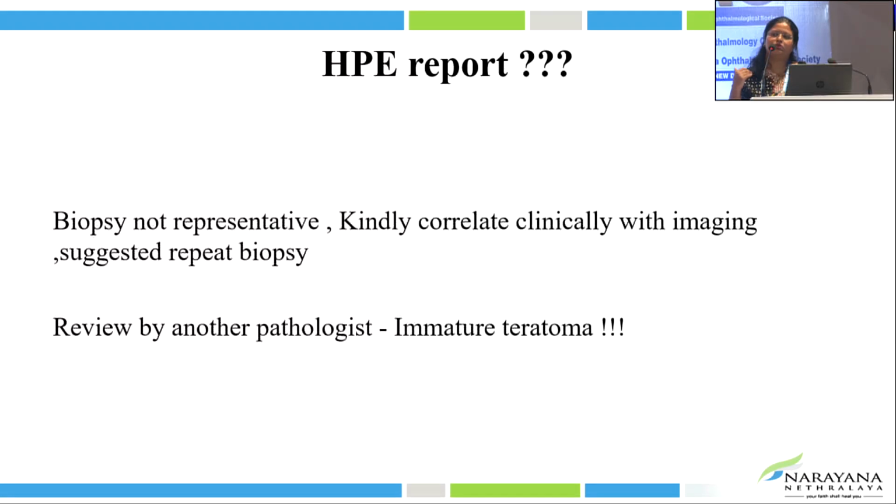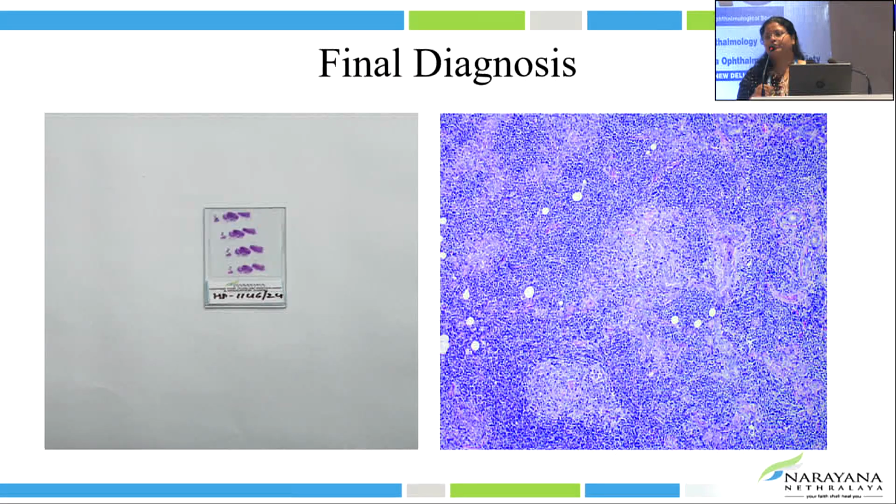So we somehow managed to convince the referral doctor. We told them all the points, and finally the patient did agree to a repeat biopsy, and this was the biopsy. Yes, we were looking at an EMZL, and this time you can see the slide from the outside, it's a lot blue.